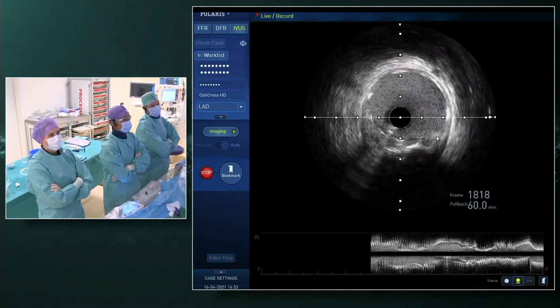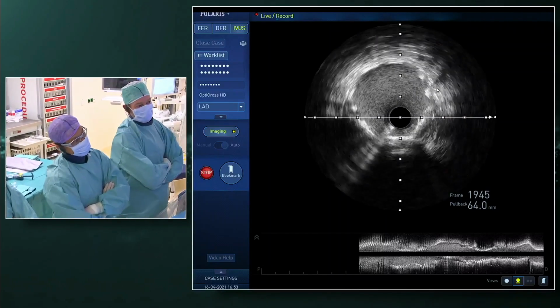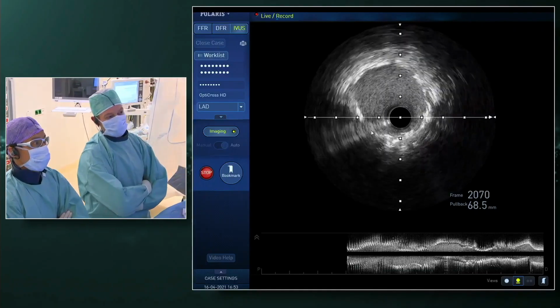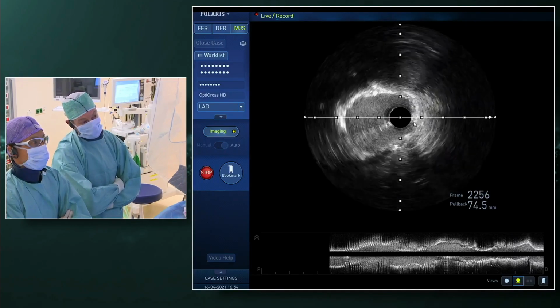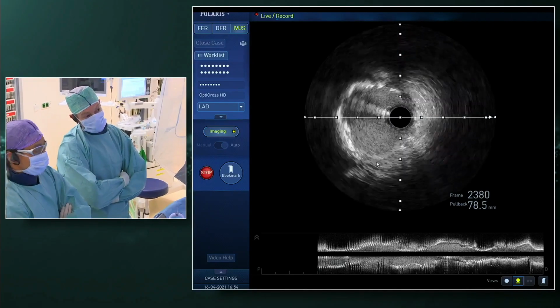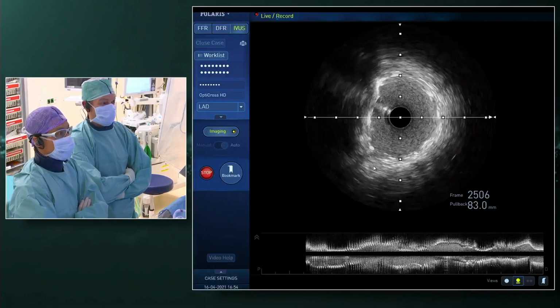This is pretty cool. We didn't make an angiogram, and we estimated the size based on the IVUS, and we estimated to land just before this large septal and diagonal branch. By the way, we managed to do it nicely round. Exactly. Look at the stent, it's nicely round. That means that the calcium gave way. That means that you got the resistance from the calcified plaque with your orbital atherectomy and with your pre-dilatation afterwards.